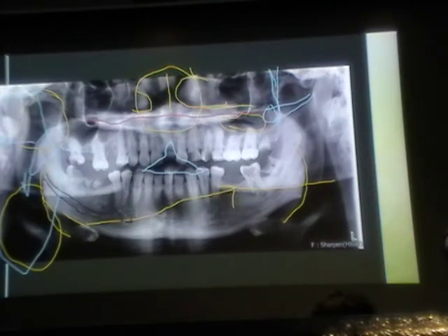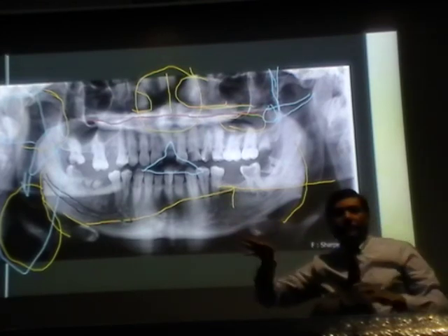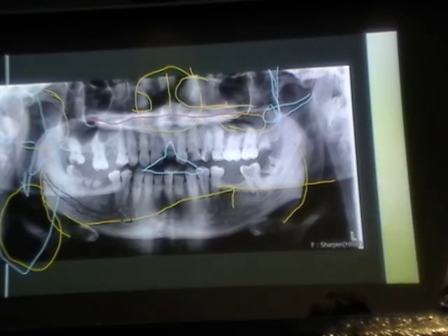Generally you would see the radiolucency from one end to the other end, so this is an exception here. Only part of it is not closed, but part of the tongue is closed. That image would lead me to believe that it would be the nasopharyngeal airspace. So generally nasopharyngeal, yes, you could use the term, but technically it's not part of that. Nasopharyngeal is above the soft palate region, like this one. So it's much higher, yes.